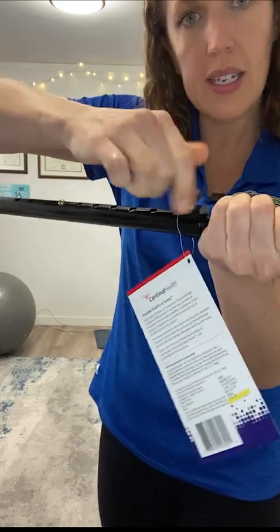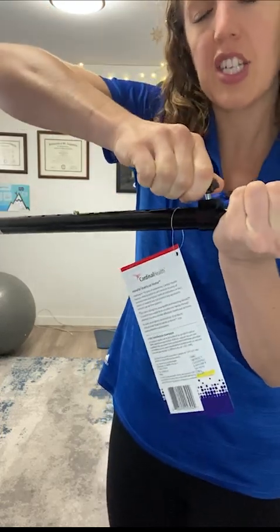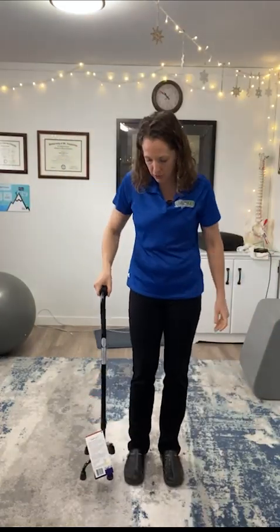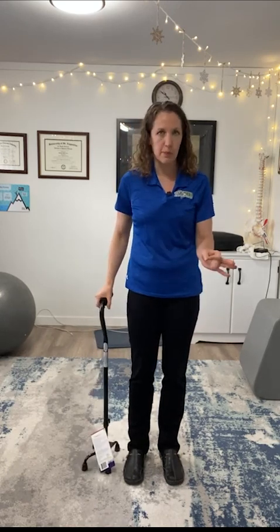Sometimes you want to crank down this little screw here, and that just keeps it really stable once you've got it to the right adjusted size for you. So now I retest — it hits me right at that wrist point. You can see from there, this is perfect.